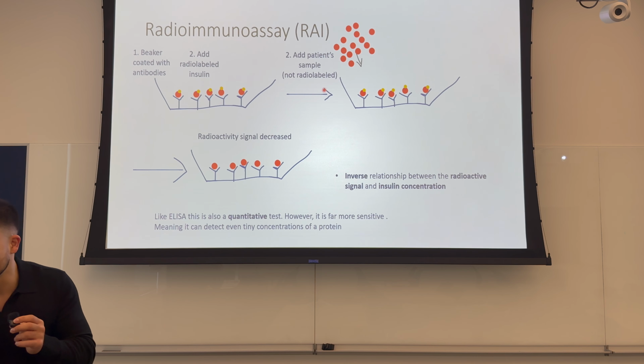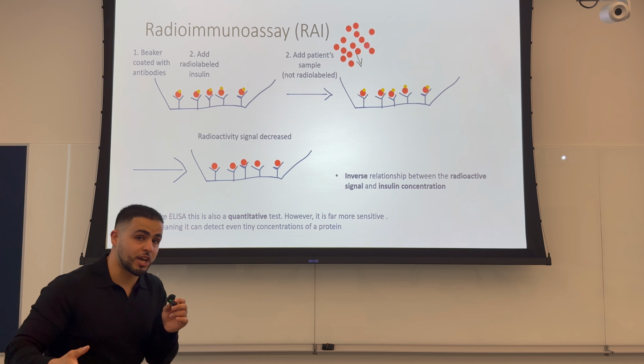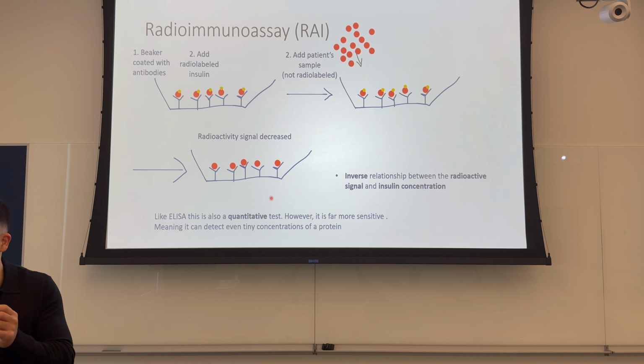So notice now we're adding a ton of extra insulin molecules. So let's assume that there was a higher concentration of insulin in the patient's blood. You can see you've displaced more of those radio-labeled insulin molecules.